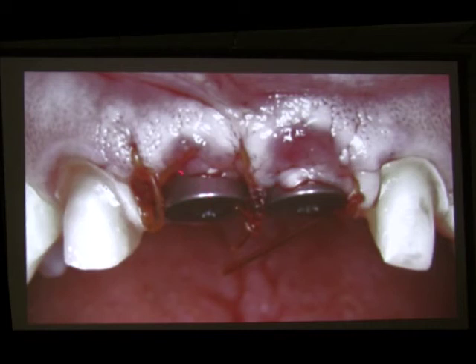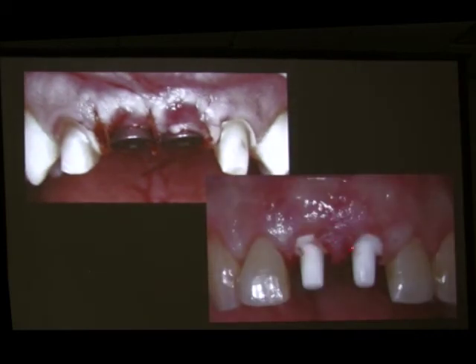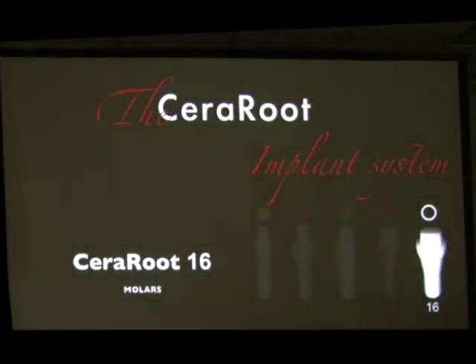In the anterior zone, with titanium implants, this is almost forbidden because we know that the papilla will not stay most of the time, because there has to be a biologic space created in between two implants. So over the years it has been seen that sometimes it's much better to have a bridge between two natural teeth when there is not so much bone, instead of placing two adjacent titanium implants. But when we have zirconia implants, the story is completely different. With zirconia implants that are restored at gum level, not subgingival, you have papilla preservation. There is no biologic space and there is no bone resorption in between two implants, no matter how close the implants are one to the other.